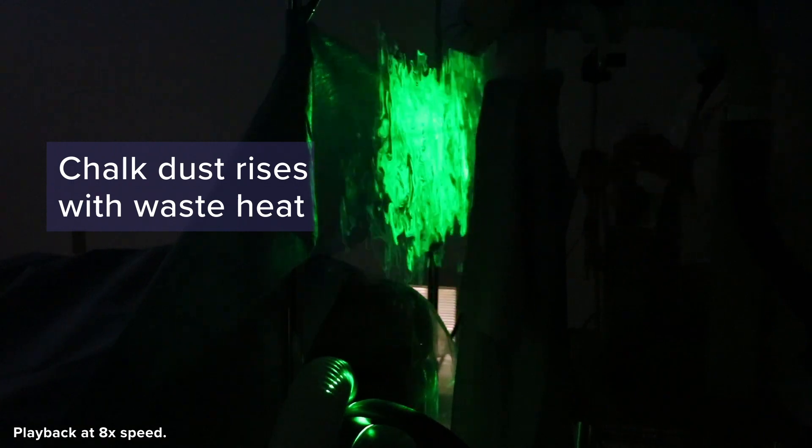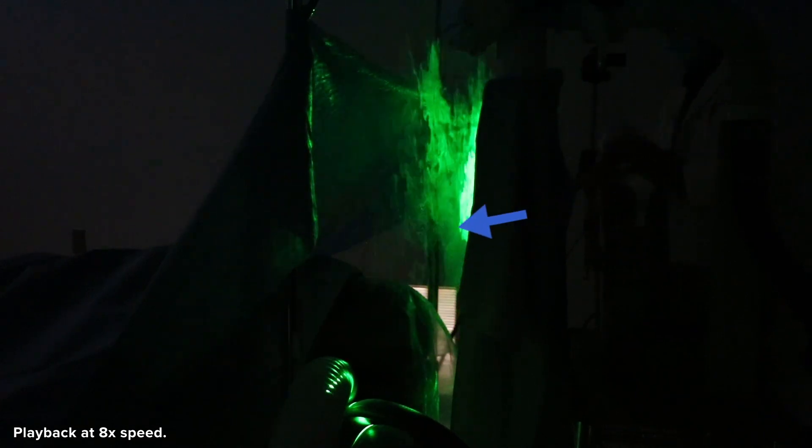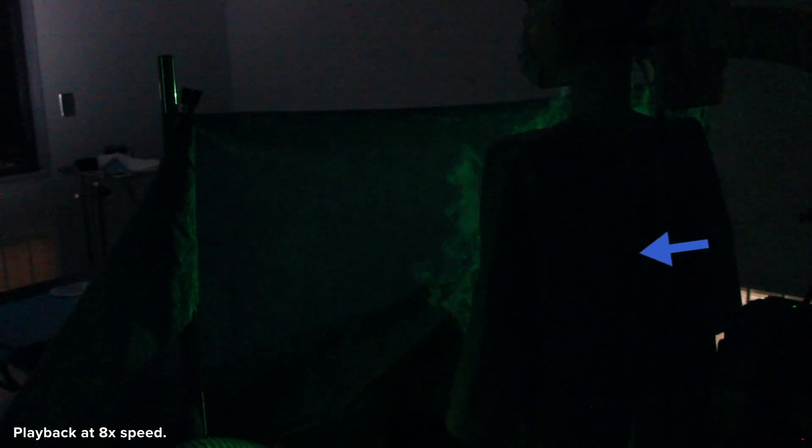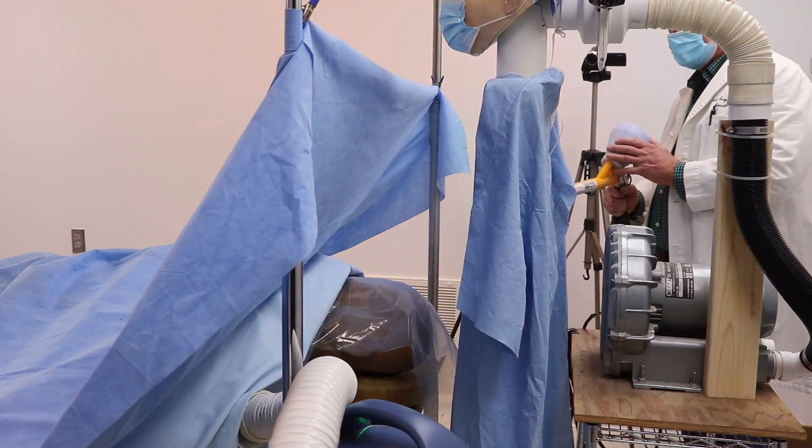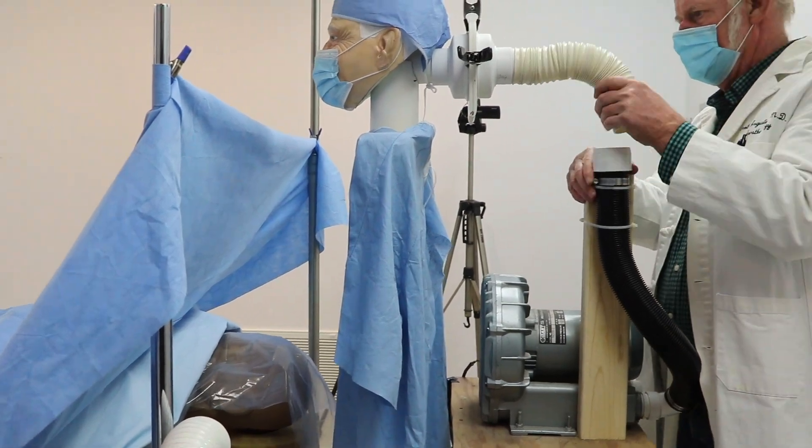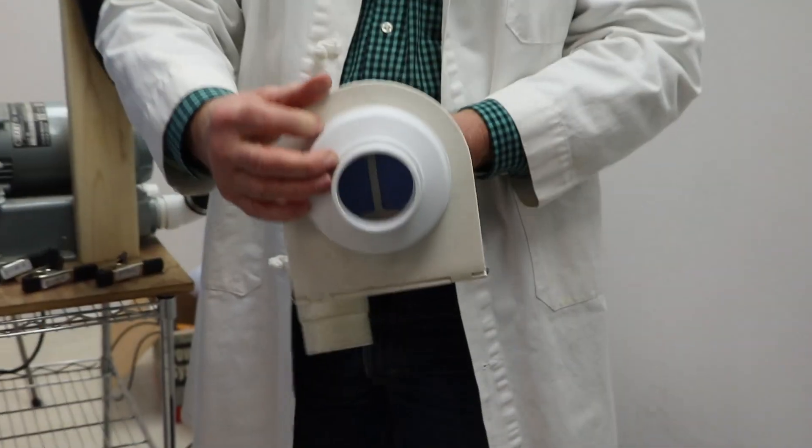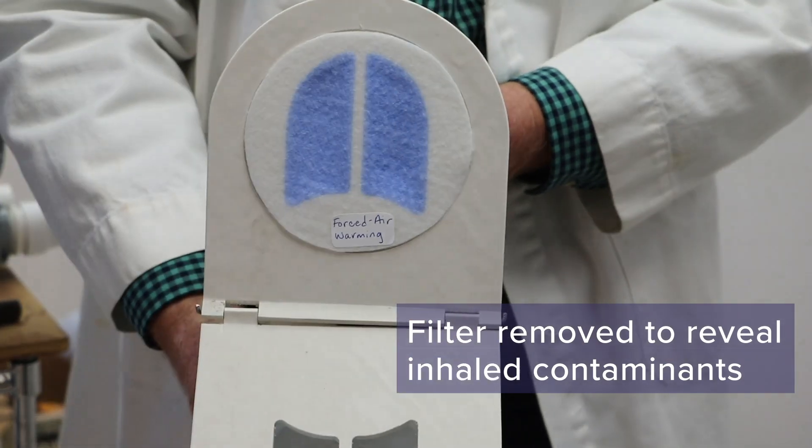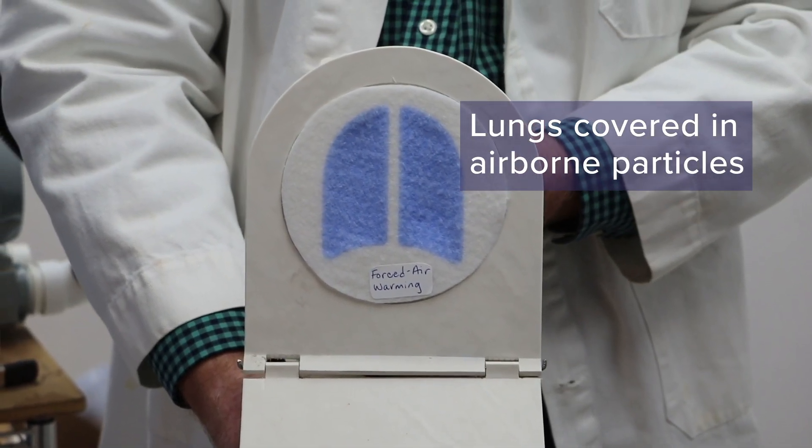The air currents of rising waste heat are easily visualized with a green laser. The filter is removed to reveal inhaled contaminants. With the forced air system on, the lungs are covered in airborne particles.